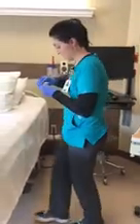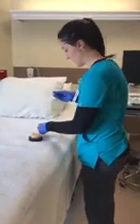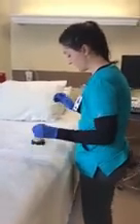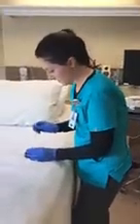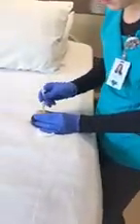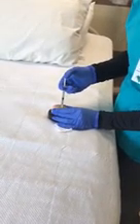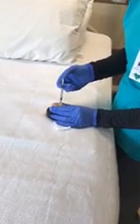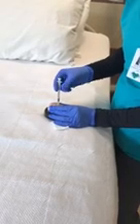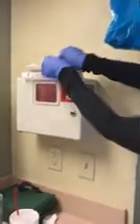Okay. So now that we have that removed a little bit, go ahead and remove my cap here. I'm going to hold this at a 90-degree angle and pinch up on that skin. All right, you're going to feel a poke, okay? Okay. All right, poke. And then I'm going to inject that with the air. And you're going to feel a sting there. And then we're going to go ahead and remove that. And I'm going to hold that gauze there for me, Bob. Okay. I'm going to dispose of this in the sharps container right away.